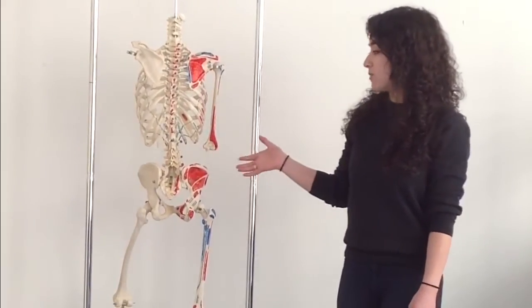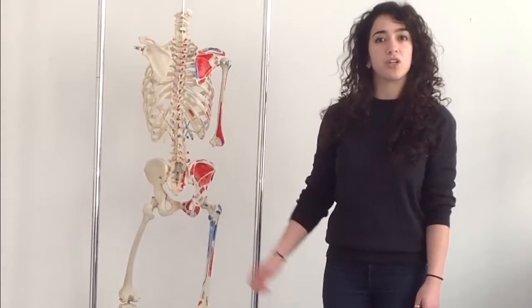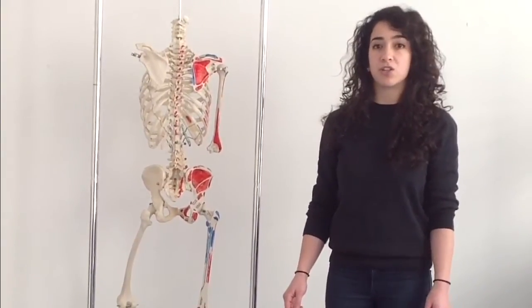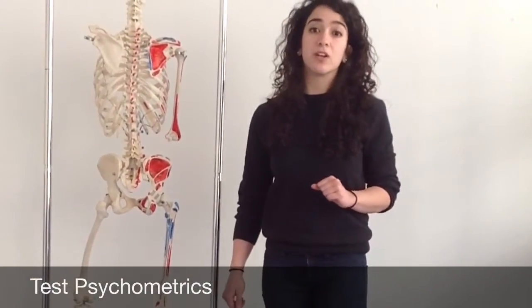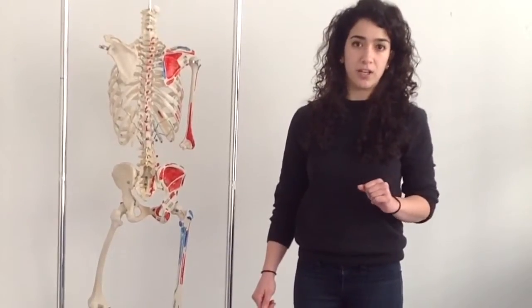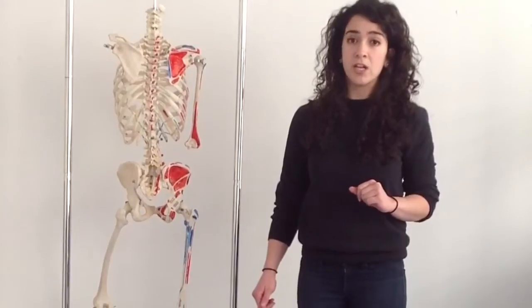You can go ahead and measure lumbar extension if you see that the patient has decreased range of motion, if they have weakness during lumbar extension, and you want to make sure that when they're performing the lumbar extension they don't have any pain. As mentioned by Norkin and White, it is important to keep in mind that all inter-tester reliability and validity for all goniometer measurements are poor.